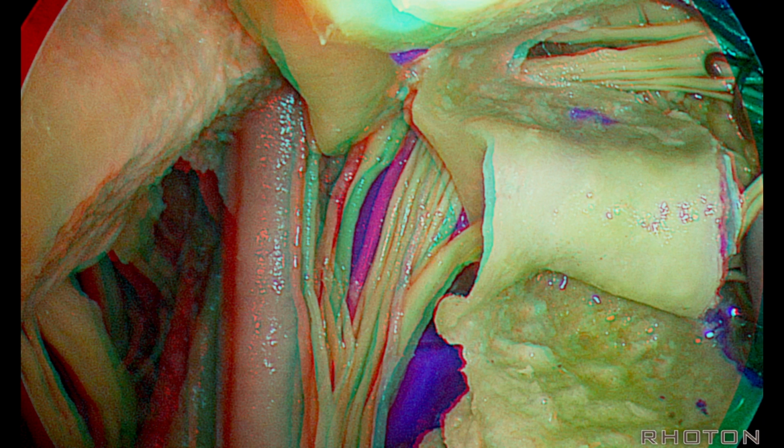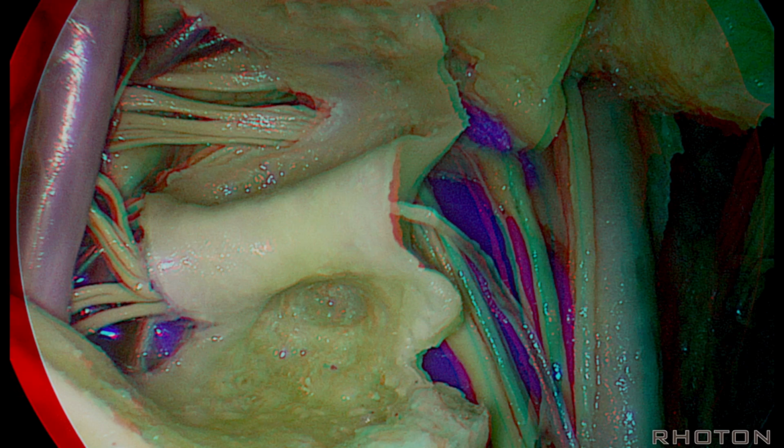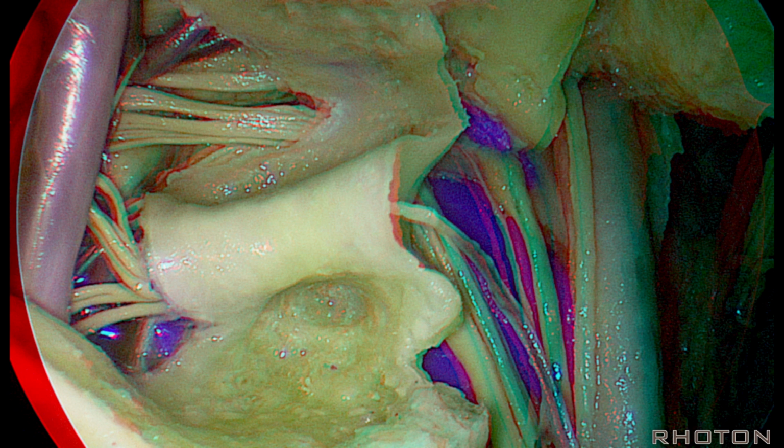The view of the nerves just below the jugular foramen on both sides.